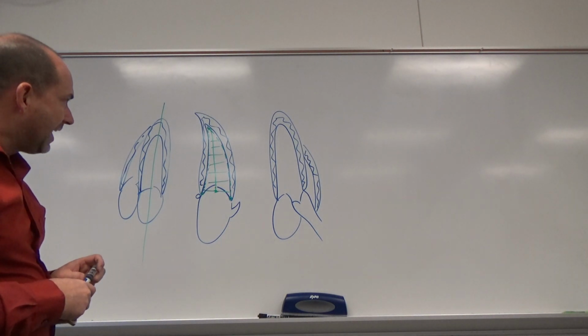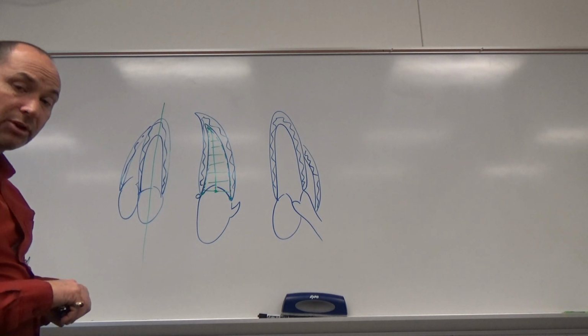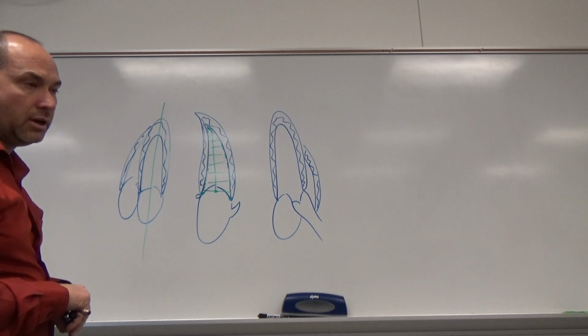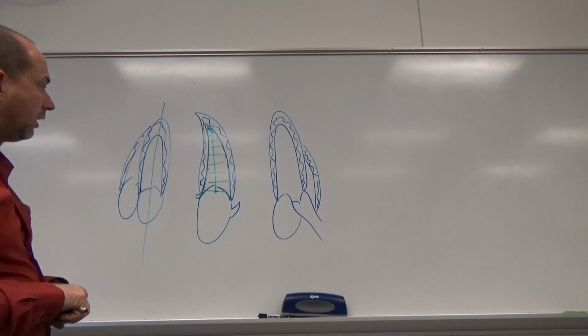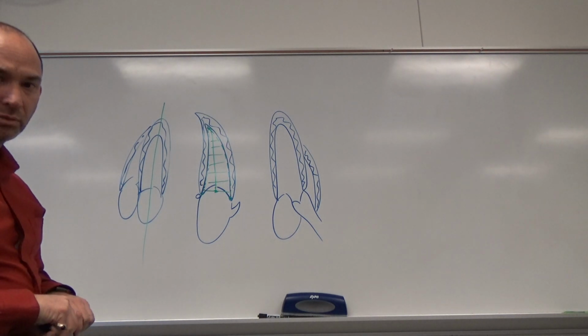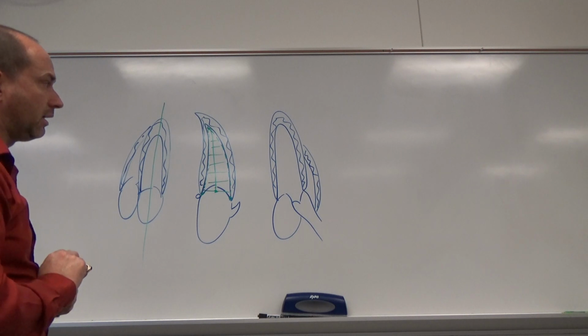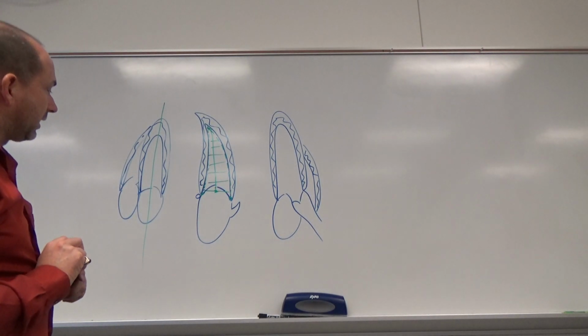So that is the extent of the apical views. That's all the measurements that we take. Remember, we did our tissue Doppler, we did our pulmonary Doppler, Doppler through each of the valves. The apical views are where we really do most of our Doppler because it provides that 0-degree angle that we need and is more accurate.